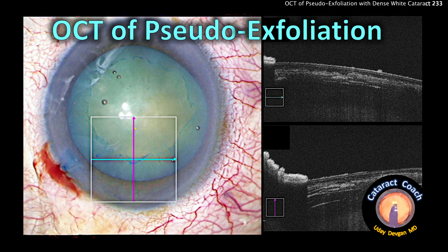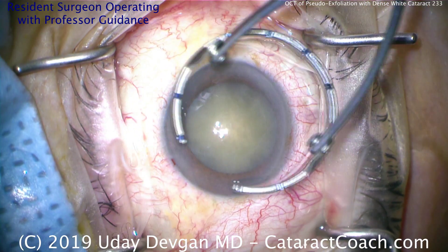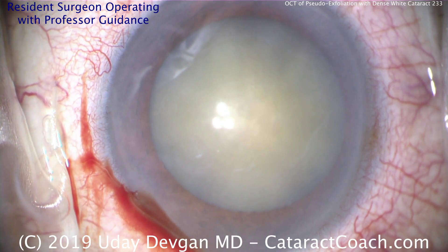CataractCoach.com. Let's look at this OCT of pseudo-exfoliation. This is a case with a dense white cataract, and the patient has significant pseudo-exfoliation syndrome, as seen on this anterior lens capsule.